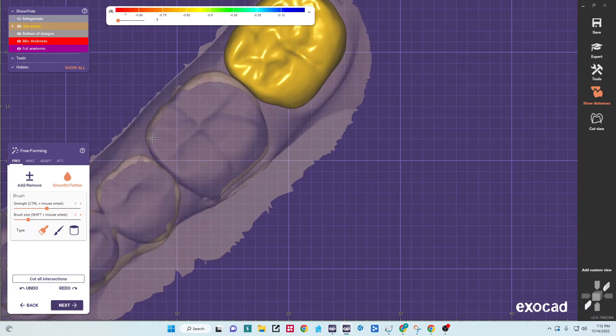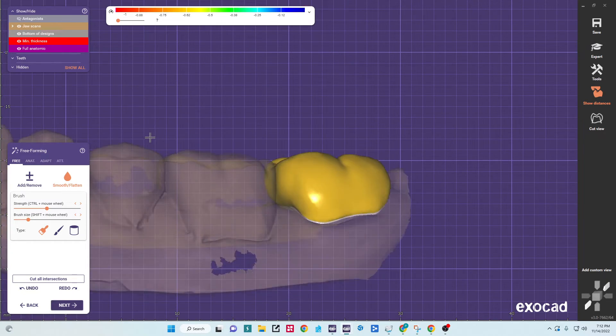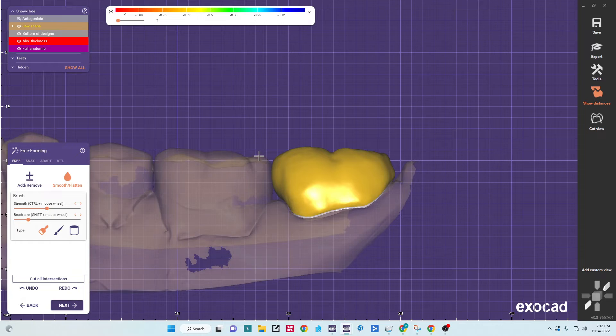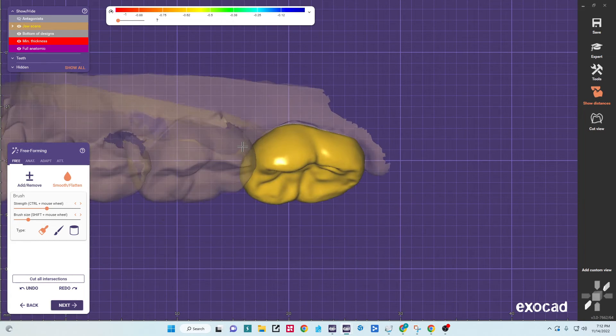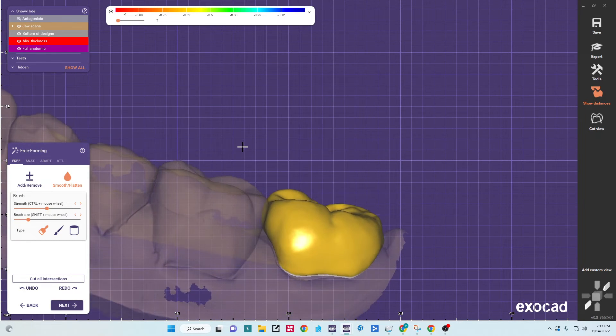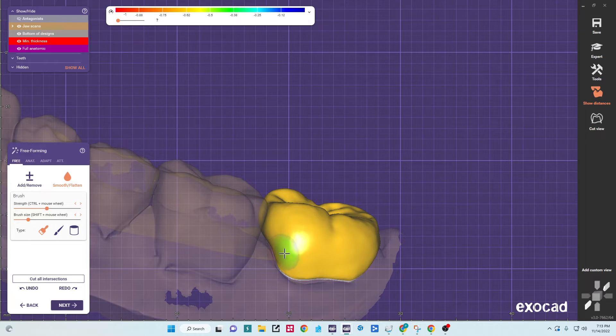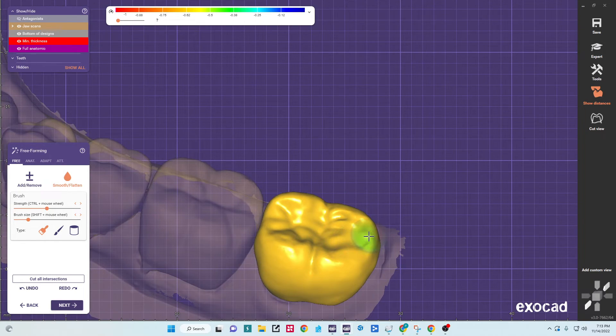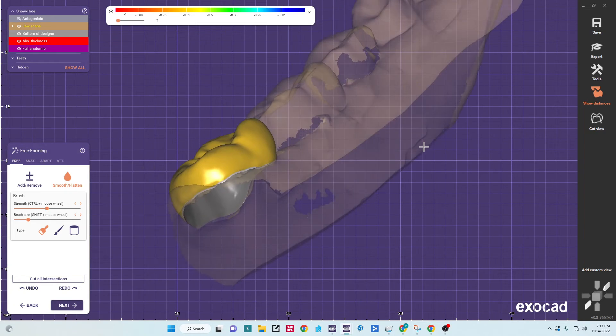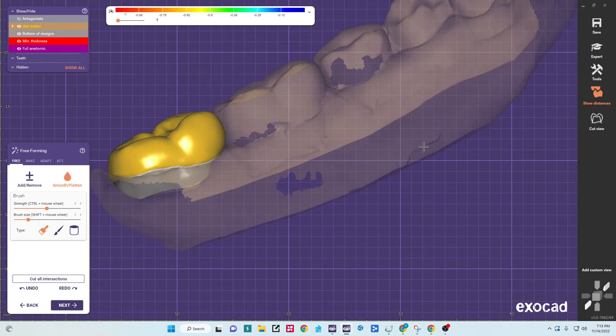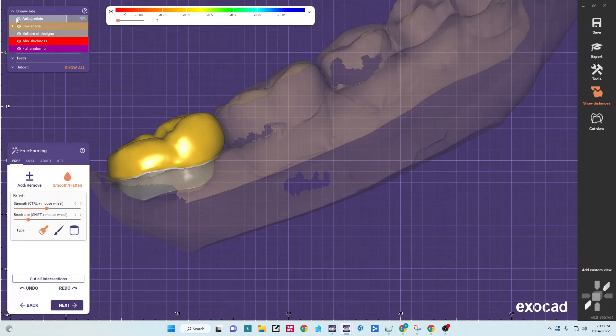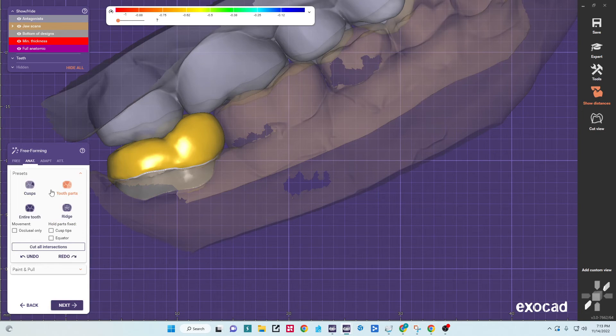And so one thing I tell our designers is we don't necessarily want it to be a perfect match to the tooth. We want a little better contact than what we would have naturally, a little broader. It just makes things easier. Okay, and we're basically there. But say we did have a cusp or something we want to change. I want to go over one more feature here.